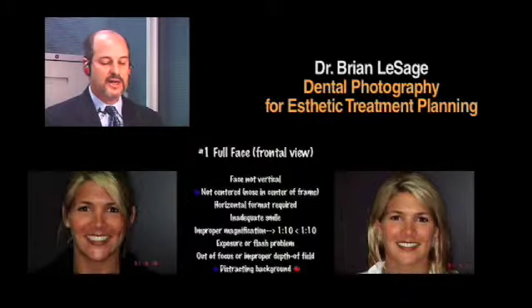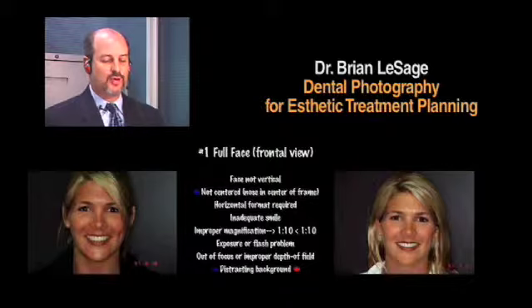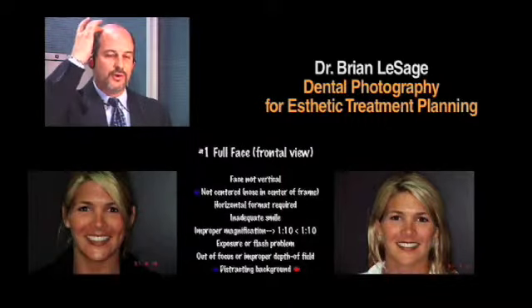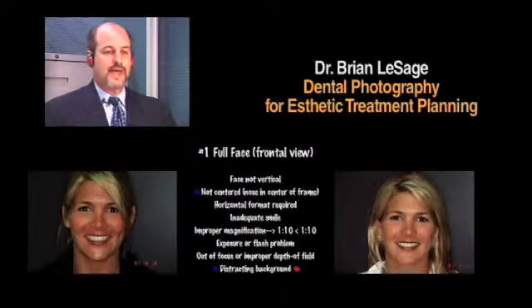Have the patient standing in what we call a natural horizontal head position. And what I always share with audiences is most women, when you take a picture of them, will tip their head slightly, I got to put the video on me for this. So the women, when you take a picture of them, will classically do this. And I'm not making this up, and I have to go over and go, no, no, give me your full head. And men, though, will do this. They'll put their nose up in the air. I don't know what that's all about. And I have to go over and say, no, give me. But you want them to kind of just relax their shoulders and look straight forward.